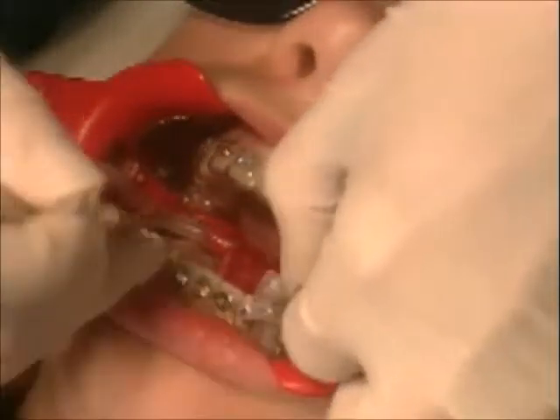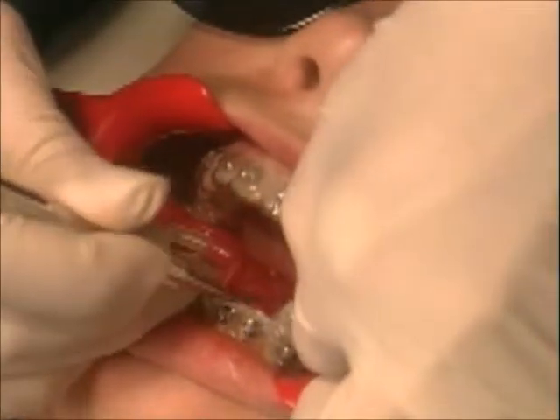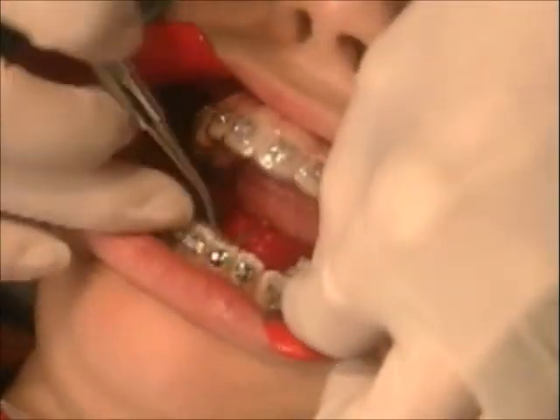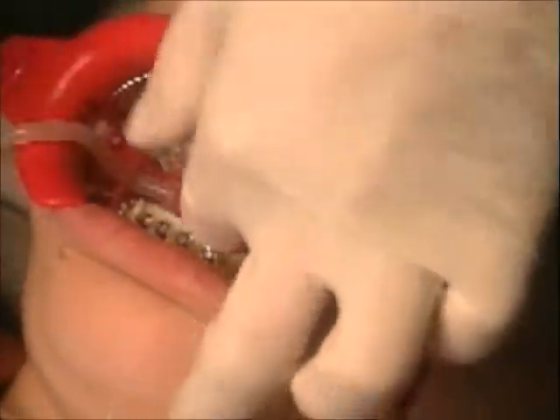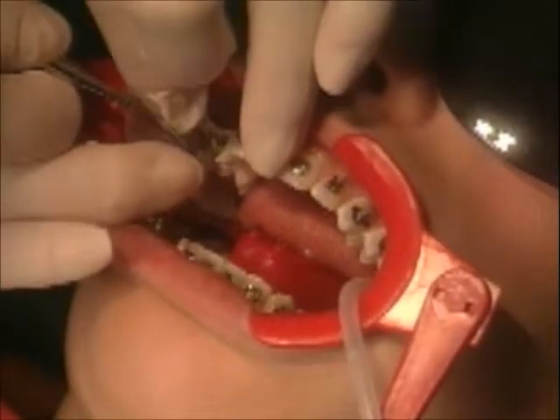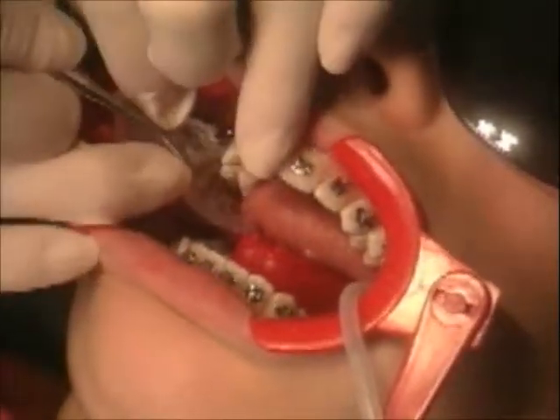Starting with the midline, peel the first half of the soft tray distally. This is where you realize the advantages of trimming around. Remove one half of the inner soft tray, pulling from midline towards distal. Because the soft tray was pre-cut in the laboratory, it will come off in quadrants.